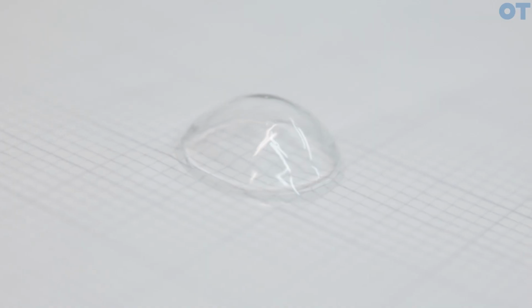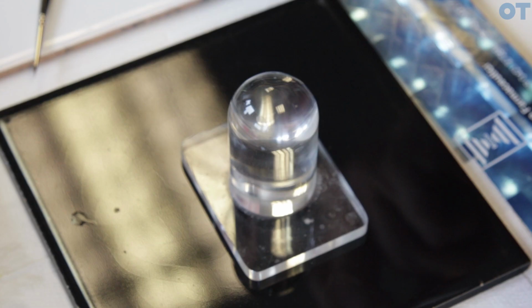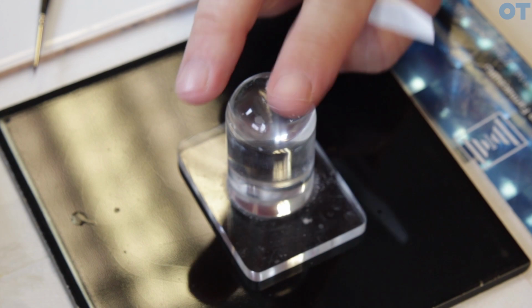When we receive the order from the practitioner, the first thing we have to do is manufacture a contact lens. That process would normally take about a day, then it will take another 2 to 3 days to hand paint the lens. So this is the one I opaqued earlier, put the black pupil on.